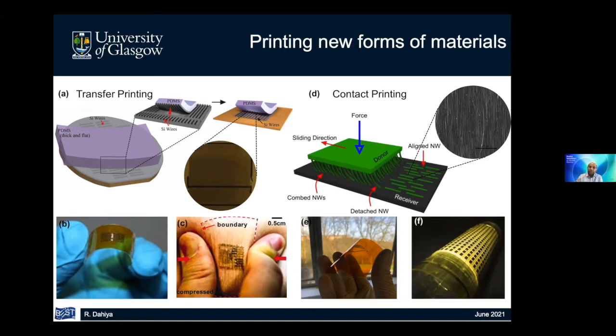Now, this is an interesting approach because for electronic skin, you are looking for distributed electronics. And if you are able to print electronic layers on a large area, you can then use that large area to develop electronics on top of this. So this could, in a sense, form the backplane. As you see, if you have displays, you have the display and then the backplane, which has electronics. So these all can be on the backplane, covered with pressure sensitive rubber or any capacitive or piezoelectric material, or a transducer material, which can possibly be replaced.